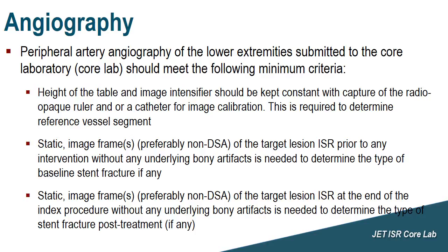Static frames, preferably non-DSA images, of the target lesion ISR prior to any intervention without any underlying bony artifacts are needed to determine the type of baseline stent fracture. It is very important that we capture these cine angiographic views and images without DSA, because on DSA stent fractures are hard to determine.